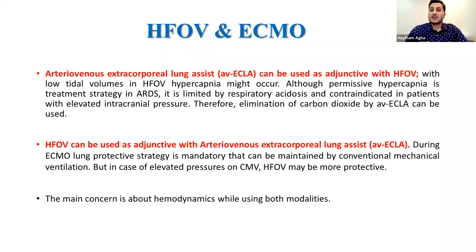Sometimes if you are targeting a low tidal volume of 2 to 3 mL per kg, you find that conventional mechanical ventilation gives the patient too much pressure. This will cause barotrauma to the patient. So at this point, high frequency oscillatory ventilation is a good option. And if your patient is on high frequency oscillatory ventilation, sometimes this patient cannot tolerate excessive hypercapnia and respiratory acidosis. So adding ECMO is a good way to eliminate this carbon dioxide.